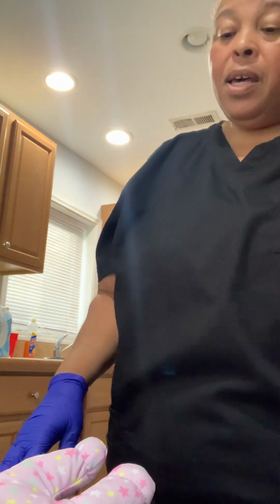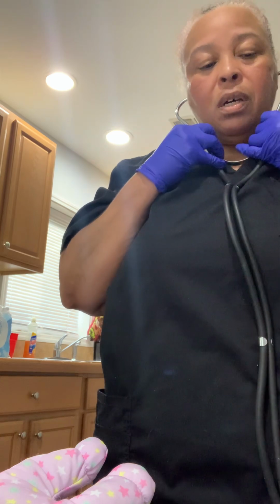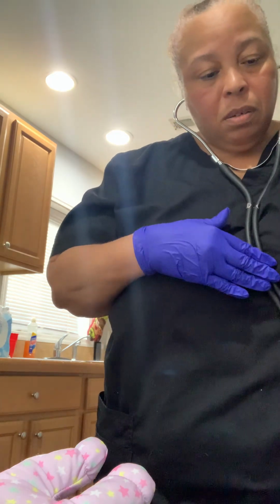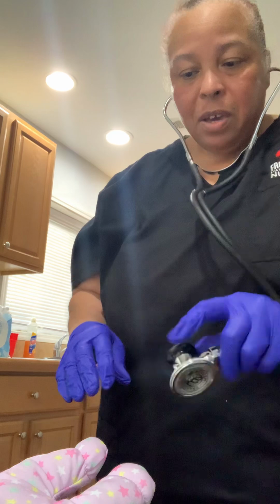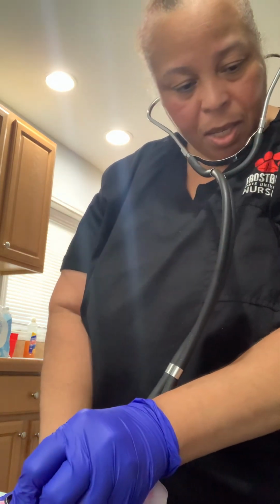Okay. Now I am going to auscultate your heart sounds. So with my clean stethoscope, I've already cleaned the diaphragm, cleaned the whole thing. And we'll go ahead and I'll go to the second intercostal space, the aortic valve. And what we'll do is we'll listen.